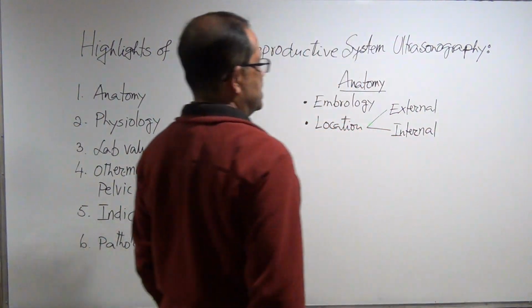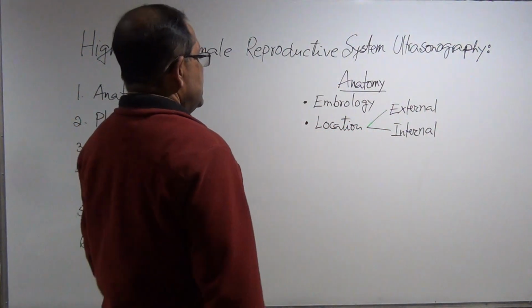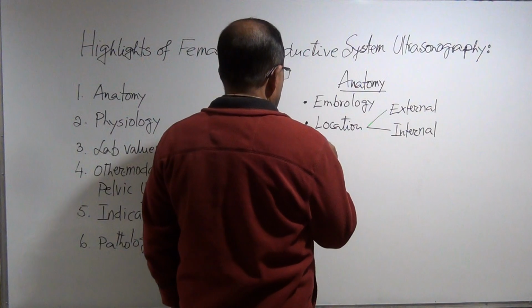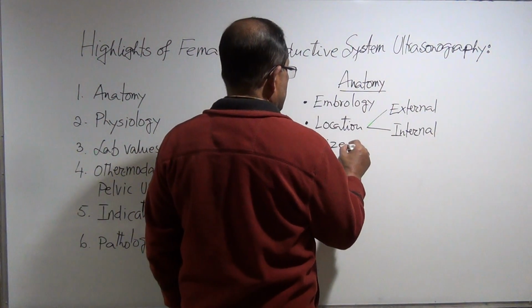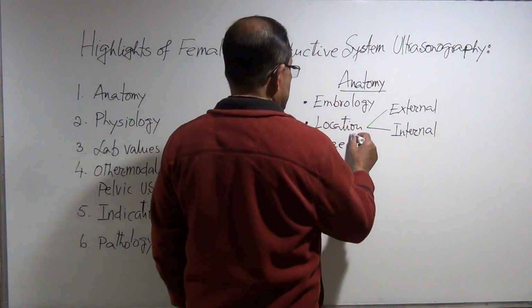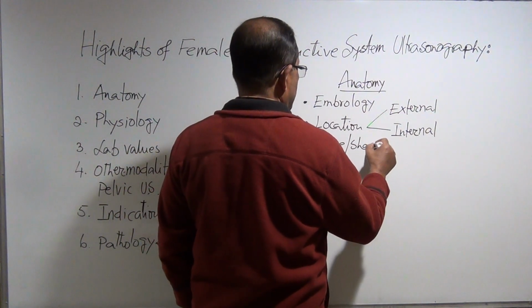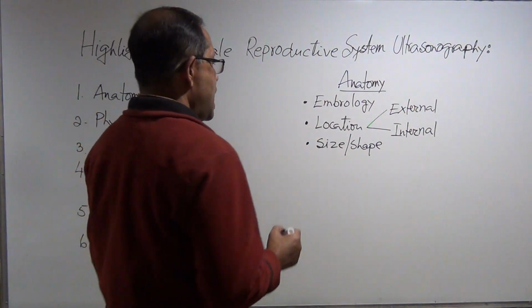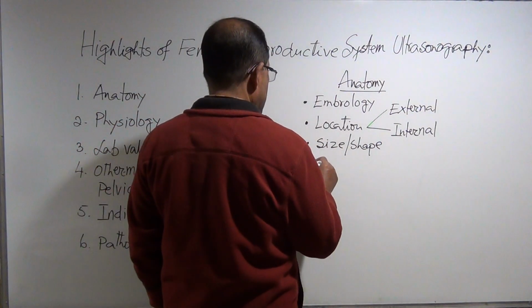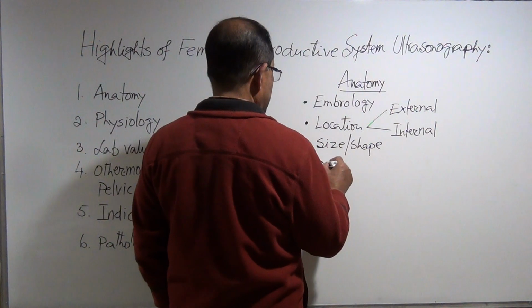We will classify in that way. Then we need to know the size and shape, and we need to know the pelvic muscles.